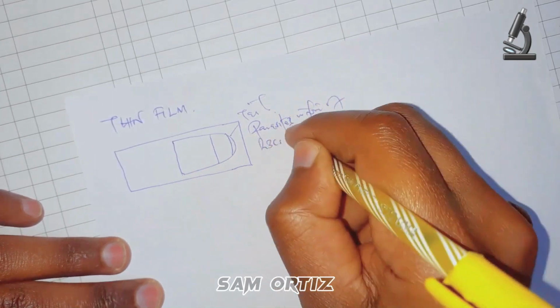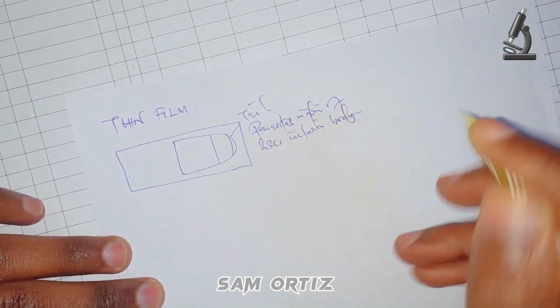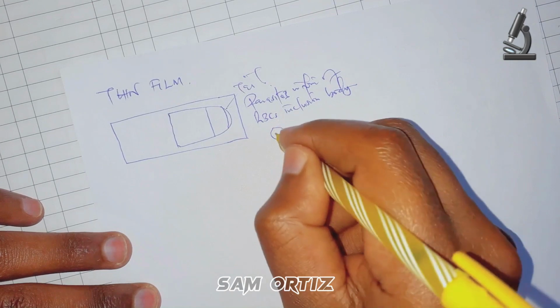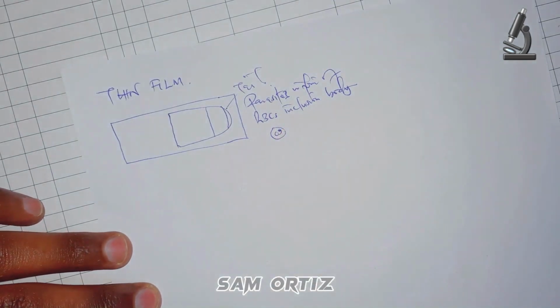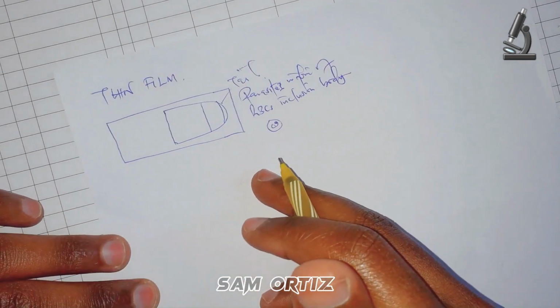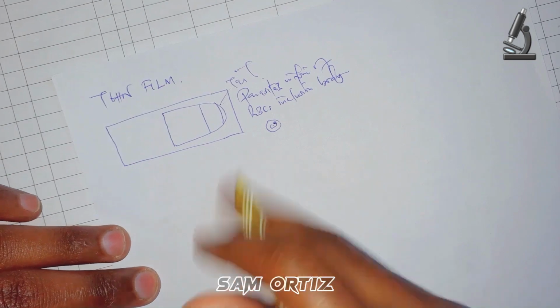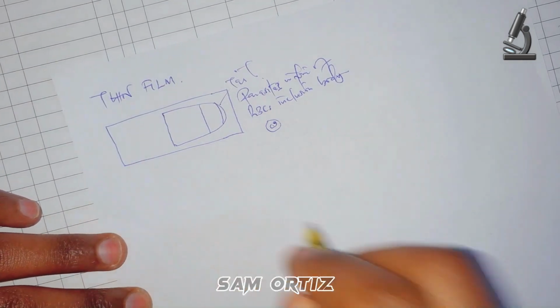And malaria parasites inside the red blood cells are now inclusions. They should not be there. They are now red blood cell inclusions. An example is that the circular one is the red blood cell, then the dot and comma is the malaria parasite residing inside the red blood cell.